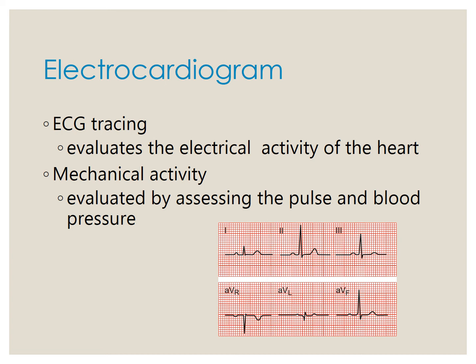The ECG cannot tell you about the mechanical activity of the heart. To do that, you need to assess your client's blood pressure and pulse. So this is just looking at the electrical activity. You could have a rhythm on the monitor, but your patient's heart is not actually beating. It's because the electrical activity is still firing, but there's no contraction, no mechanical activity. So you always want to assess your client's blood pressure and make sure they have a pulse.